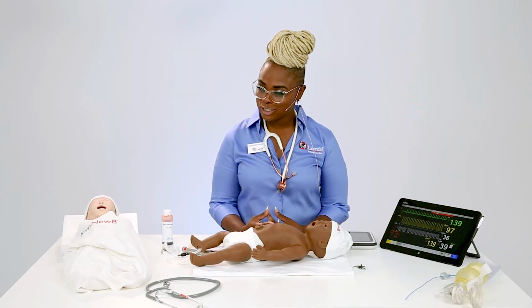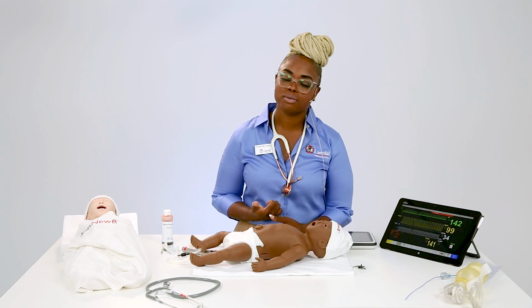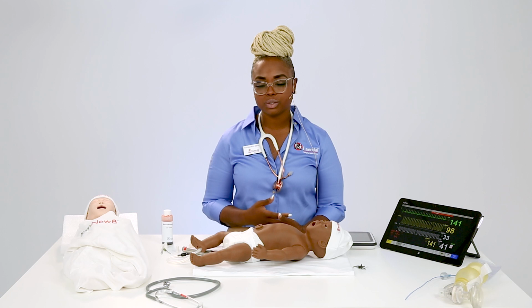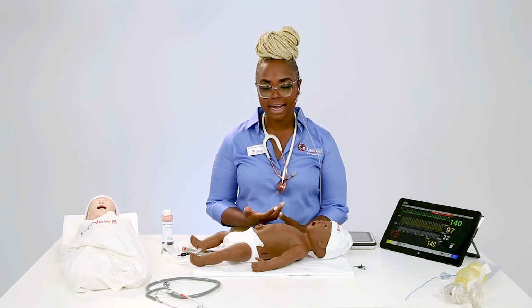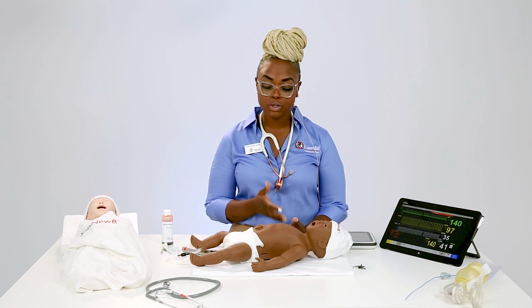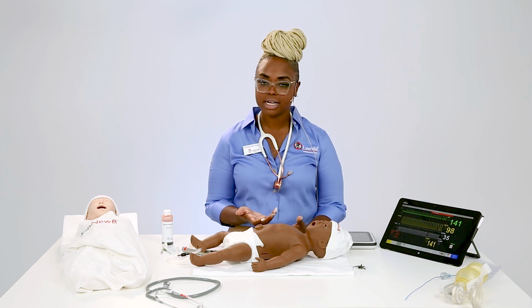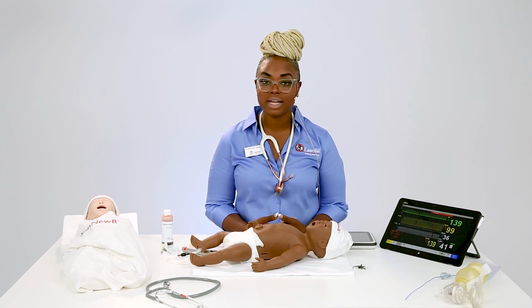I'm not sure. Let's see how good you are. Can you demonstrate the pneumothorax mode and the process of needle decompression? Unfortunately, I do not have a needle here to provide that needle decompression. The recommendation, though, is to use a smaller gauge needle to ensure longevity of that component in that system, because it's only self-sealing to a certain degree. From my practice utilizing SimNewB in the past, you are able to hear the psst when you are needle decompressing. Granted, I haven't heard that in real life, but it is a good representation of when you want to utilize that skill or technique.